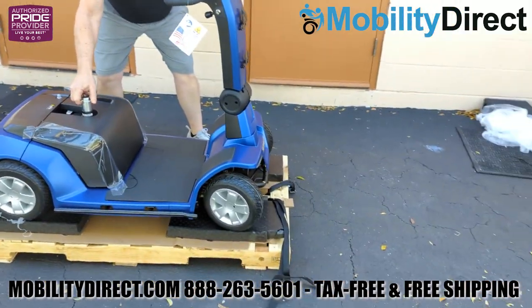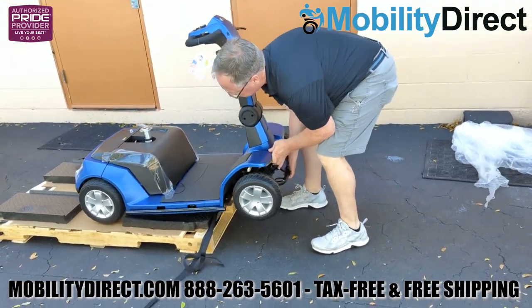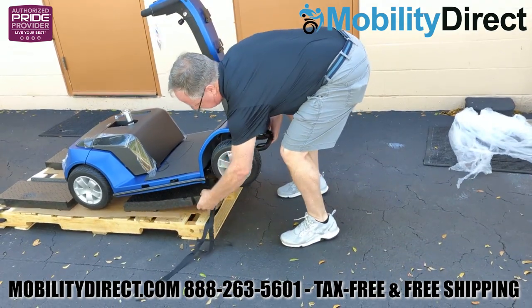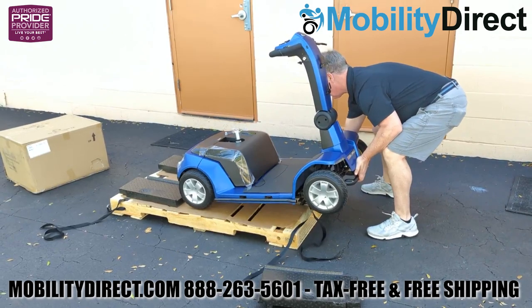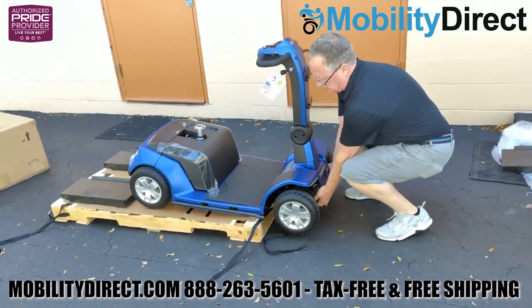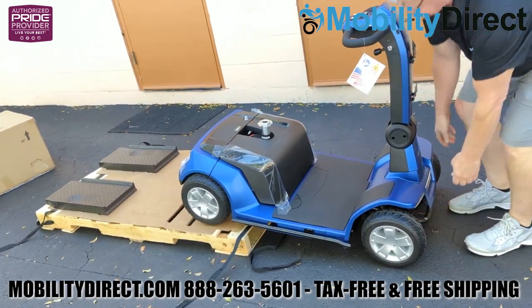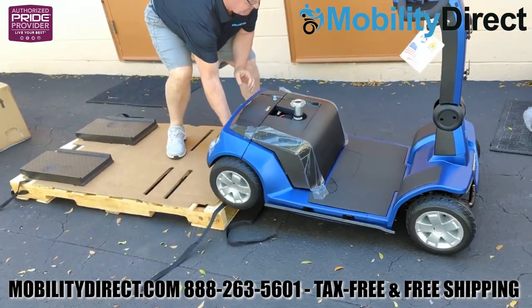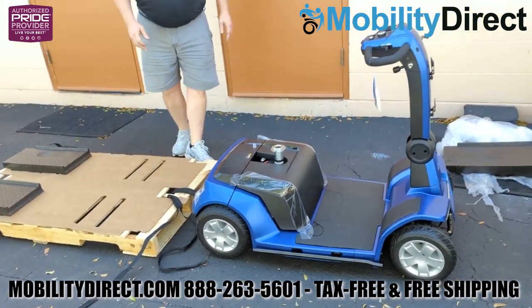We recommend removing the pieces of padding on the front. Once you get the front two wheels off the lip of the pallet, go ahead and lift the front of the scooter and then pull those pieces of matting out as shown here. Once you do that, move the scooter forward just a little bit so that the front wheels are resting on the ground, then just grab the back of the scooter by the frame and roll it right off of the pallet.